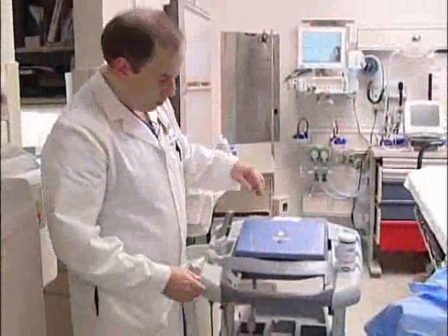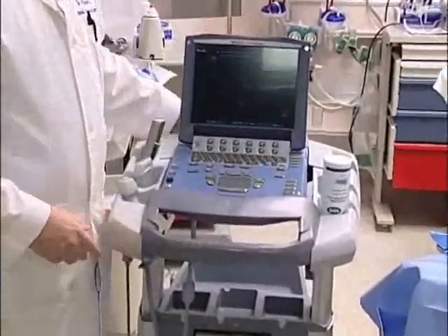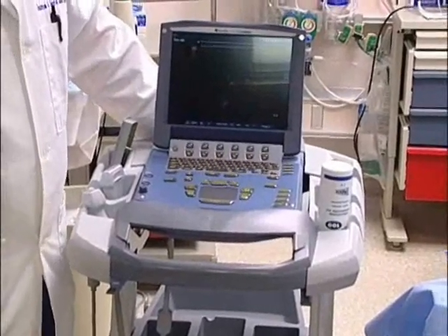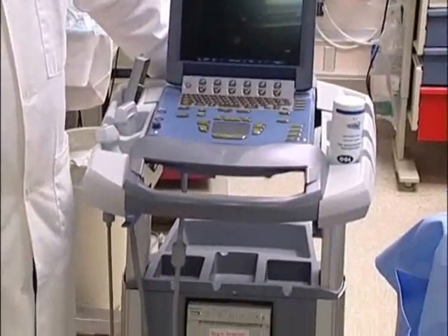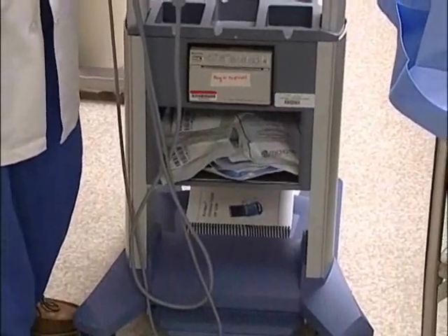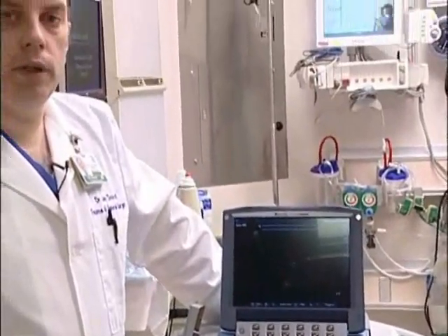The Sonosite MicroMaxx ultrasound is a compact portable ultrasound unit which is capable of doing a wide variety of ultrasound techniques. It is capable of doing vascular and Doppler type ultrasounds and is quite portable and has a battery which allows it to be used at the bedside. Use of ultrasound to insert central lines has been shown to decrease the incidence of complications.